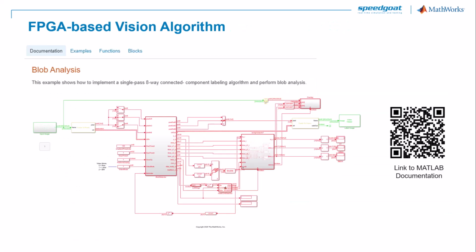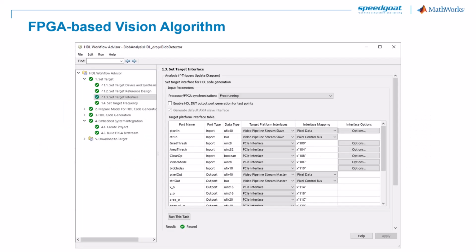The algorithm I'm using in our robot arm example is based on a shipping example from MathWorks' Vision HDL Toolbox, which I'm linking here. Again, the model is far too complex to discuss in detail, but I encourage you to take a look for yourself. From this Simulink model, we can then generate HDL code to deploy onto our FPGA. By simply going through the HDL Workflow Advisor, this is where we map Simulink signals to hardware interfaces, define clock rate, and so on. It's a simple step-by-step process, allowing you to seamlessly integrate high-speed vision processing into your real-time tests. This could be tremendously useful for medical imaging such as radiology.